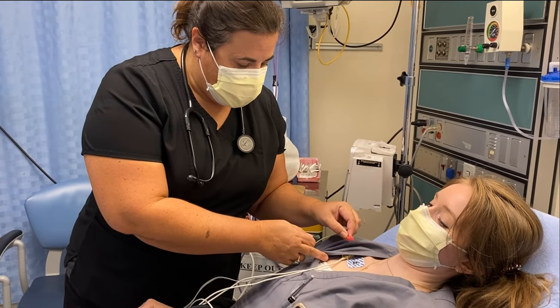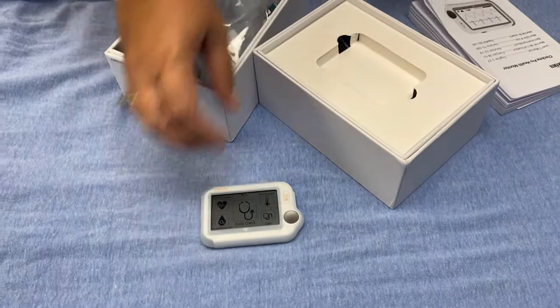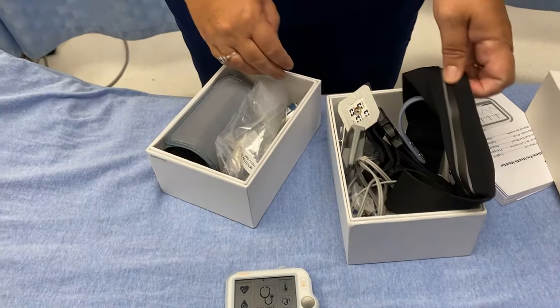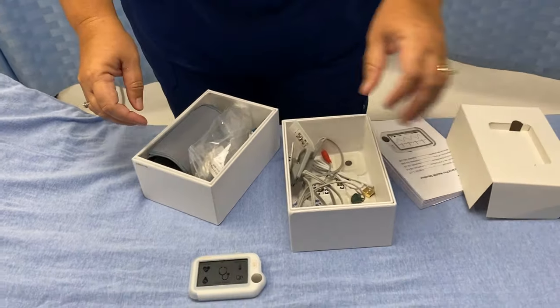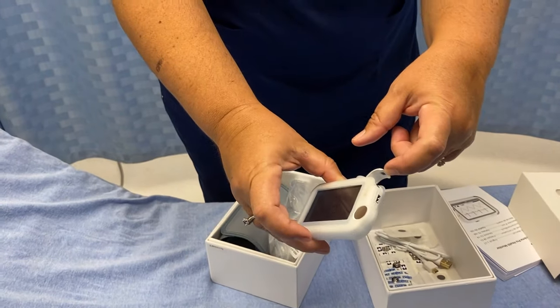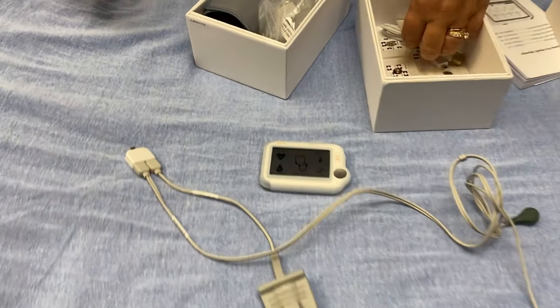So this is the monitor — it has a touchscreen when it comes on, and it has all the heart EKG, pulse ox. These are all the straps if you want to wear it, and then you have your pulse ox with your leads. There's also a pulse ox on the machine itself and leads on the machine — the bar and the circle button — so you can do EKG or pulse oximetry by directly touching the machine.